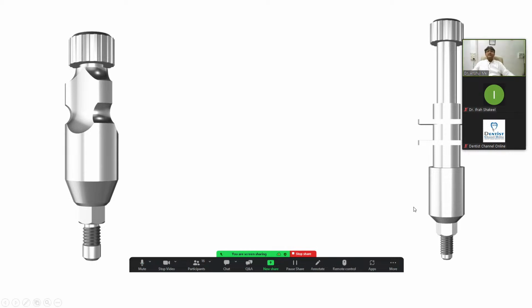So everything is digital. It starts from taking the OPG, IOPA or CBCT up to giving the prosthesis, because after placement we are also doing the same thing, taking a CBCT and all.